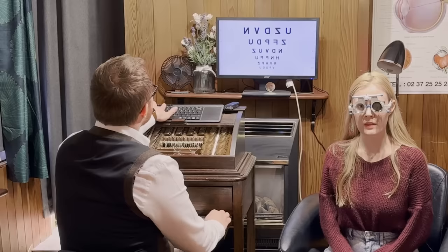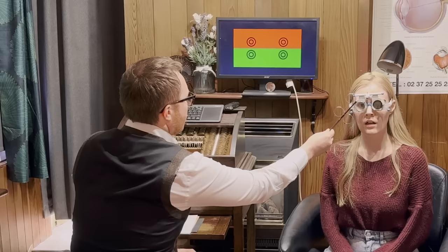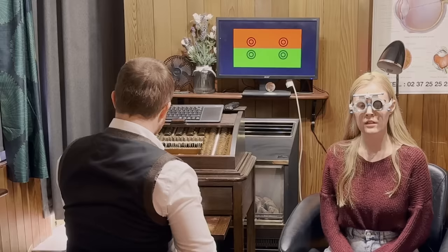Now, the next thing I'm going to get you to do is to have a look at the circles on the red and the green there. And the clarity and definition of those circles, would you say it's better on the red, the green, or are they about the same? The red is a bit better. Okay. So if I were to pop this lens in front, a bit more on the red, a bit more on the green, or are they about the same? I think the green actually with this one. That's good. I'm just going to swap that lens over.